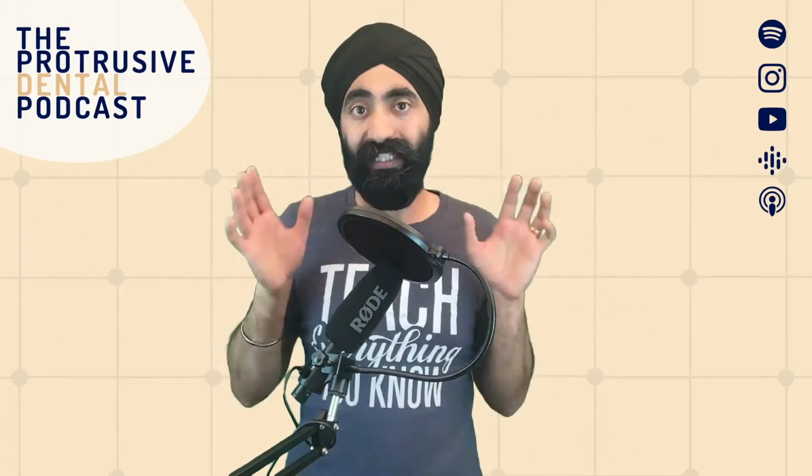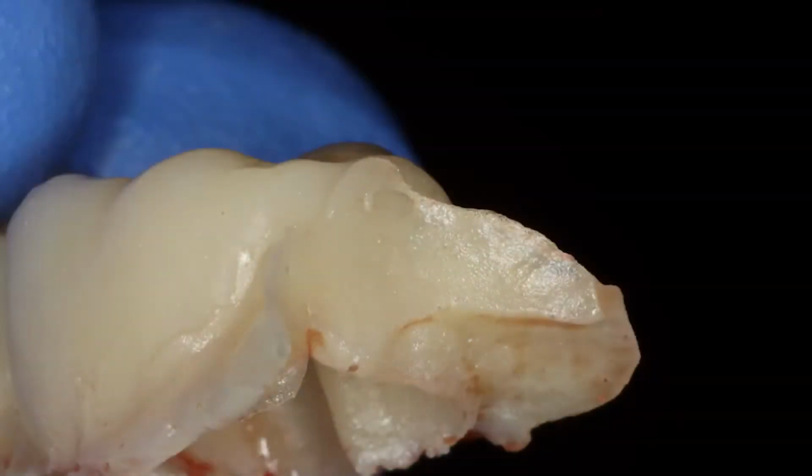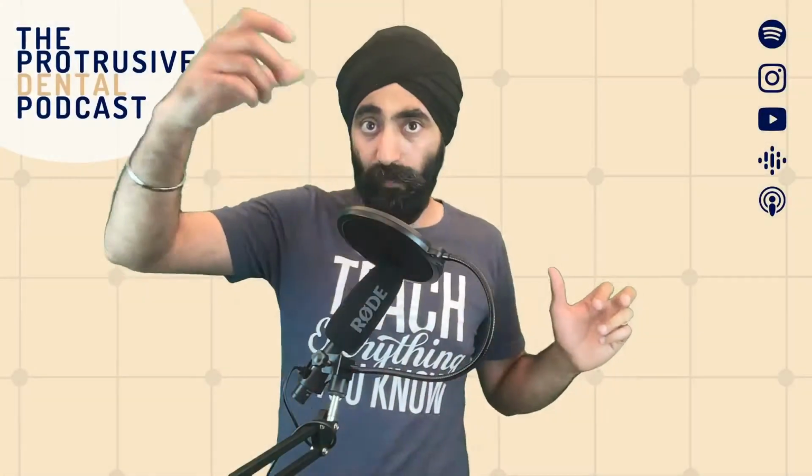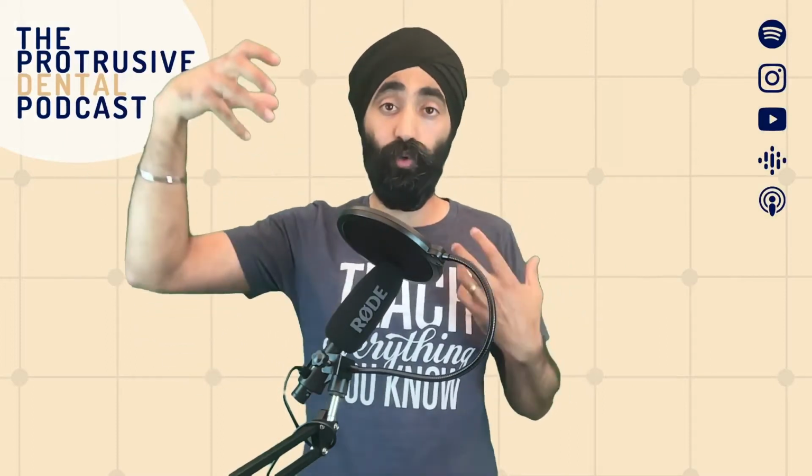Let's say you are making a direct temporary crown using a bisacryl material, Luxatemp, Integrity, ProTemp, you name it. You fill in your putty, make the temporary crown, take it out, and then trim it with a soft flex or diamond to make sure it seats on perfectly.